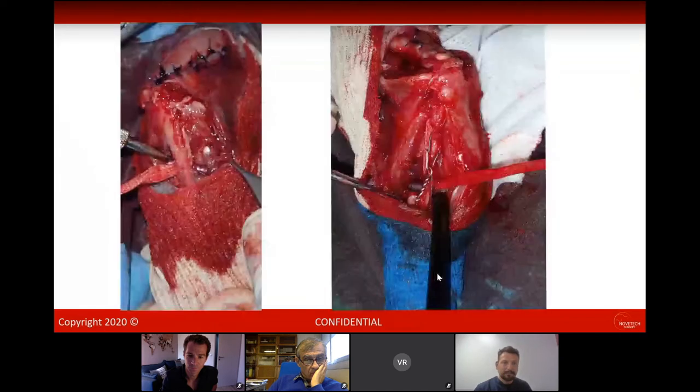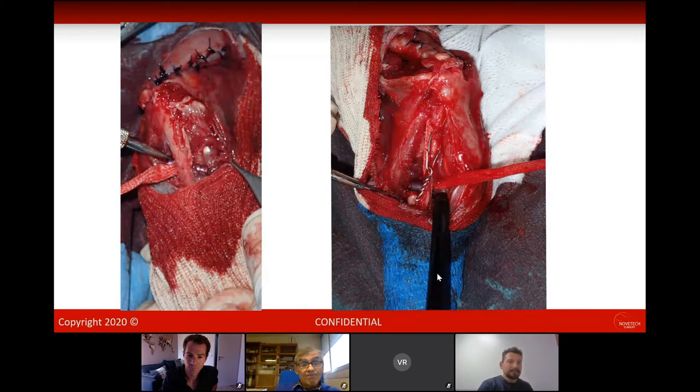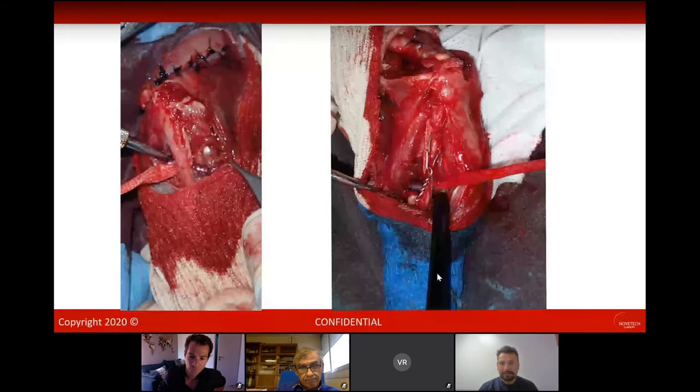And it's at this moment that we can have a major complication. On the left side, we have Pussycat. There was no problem with Pussycat because it's a 4.5 kilogram cat, quite big, so we have some material to put a screw in. For Pirouette, it was more complicated, and when we screwed in the interference screw, we heard a crack. It was the ulna cracking, so we fractured the ulna. Immediately we stopped and we put a lower tunnel, a lower screw, and we used a guide wire to ensure that the forces will be good and we won't have another crack. So we put it in and we cut the extra ligament.